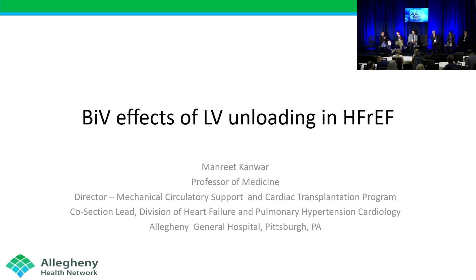Manreet, a lot of this is nuance in the details. So just out of curiosity, when you were on the Impella 5.5 and you looked at the console, were you seeing LVAO uncoupling? Because usually we use that as an indicator that the RV has either a fixed obstruction with the PVR, your PA systolic was still around 57 despite having the LV unloading, and that uncoupling is usually a harbinger of badness. Yeah, I don't recall, to tell you the truth. I wish I could tell you we did do all that. I think we looked at the hemodynamics, felt comfortable, and went ahead, but we should have, but we didn't.